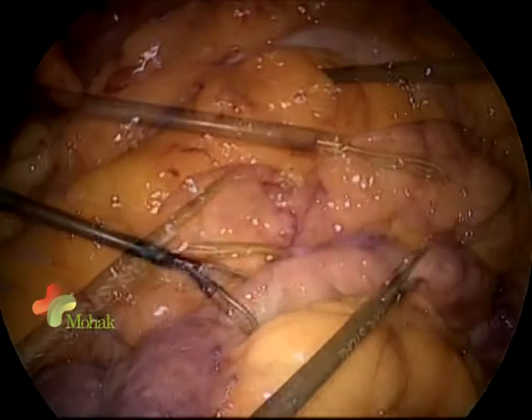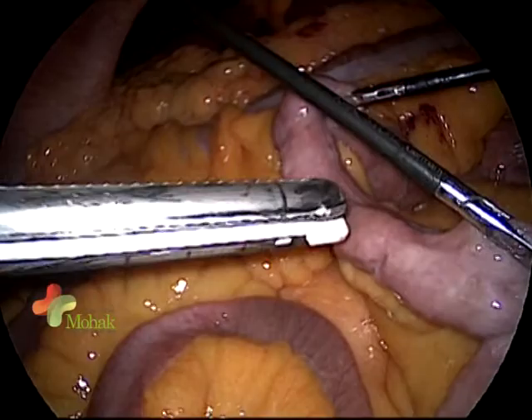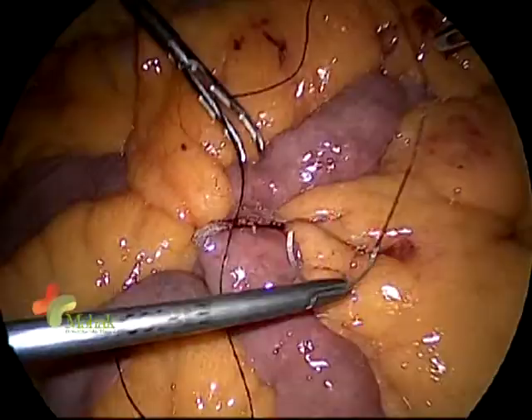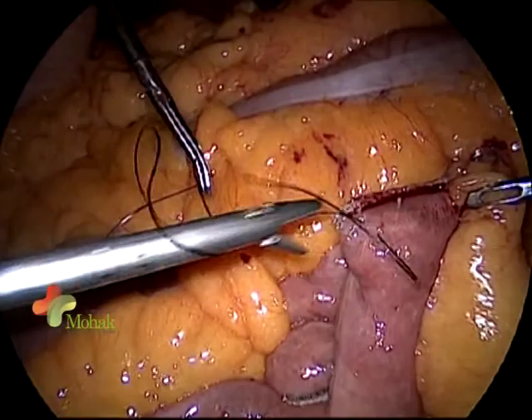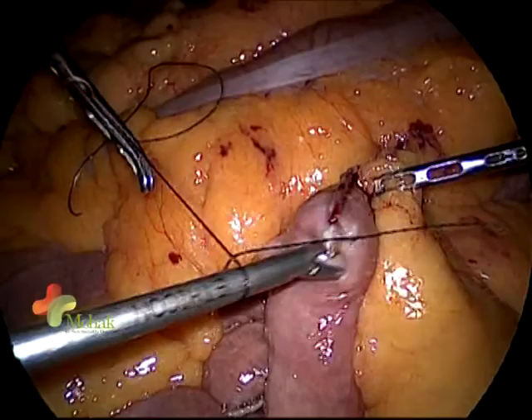Going near the ligament of Treitz, follow the bowel to 75 centimeters from the duodenojejunal junction. Once I have followed 75 centimeters, I take a white cartridge and divide the bowel exactly at the midline with both the bowel and mesentery in between. As you can see, it is totally hemostatic.